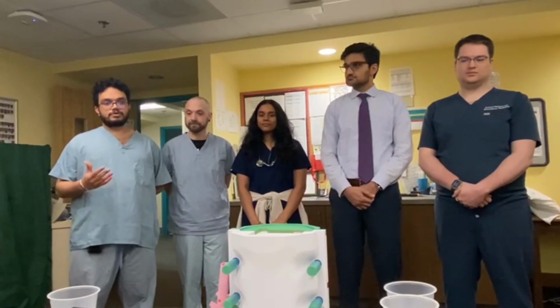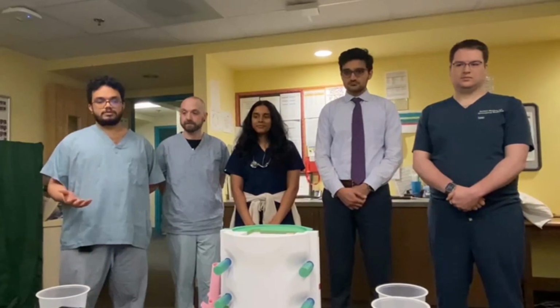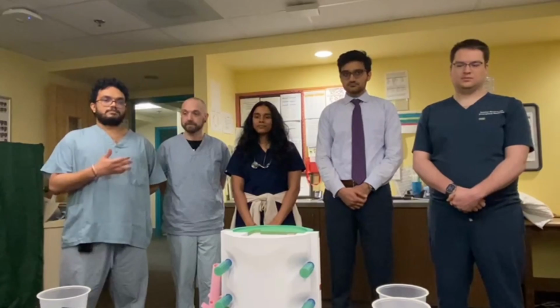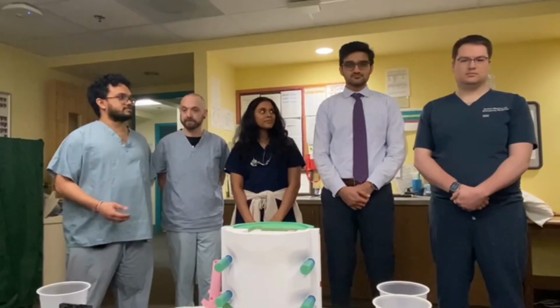We've actually 3D printed an intubation / bronchoscopic model for use around the world, especially in austere environments, using very cheaply available materials. This project is an endeavor by all of us, and I think we should all introduce ourselves before we start.